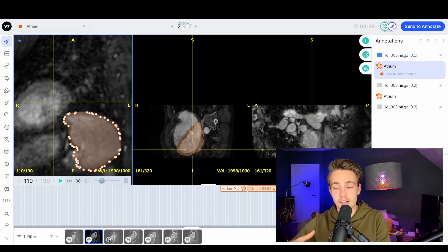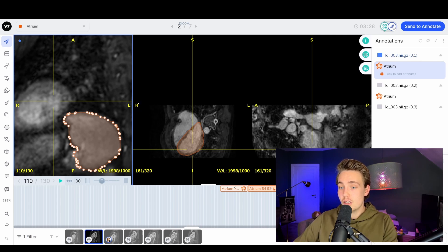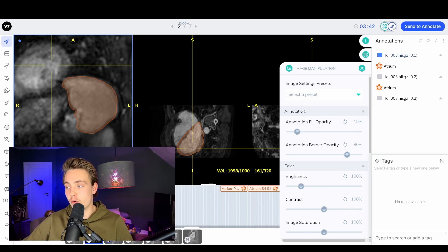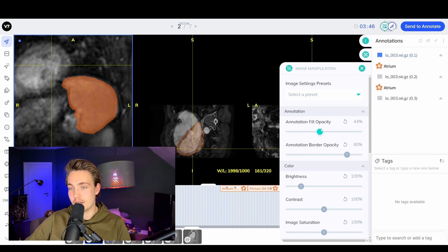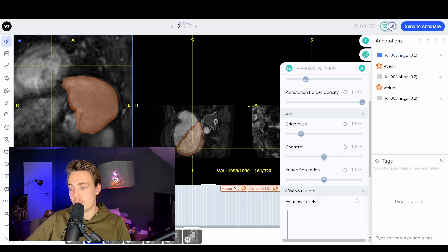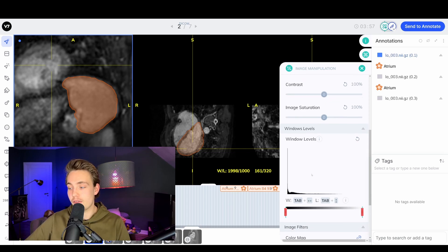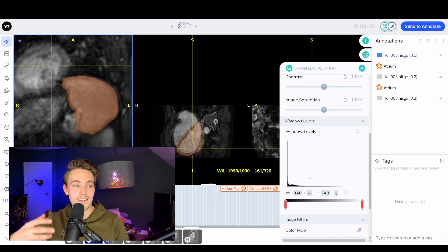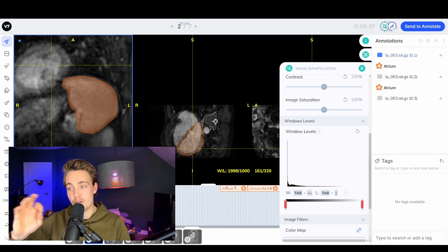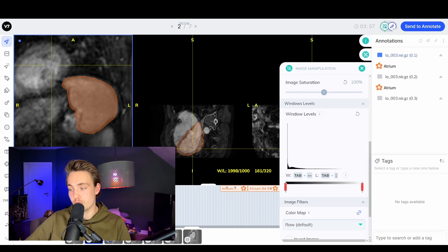We can get these different views when annotating medical images. If we go up to the top, we have some image manipulation tools. We can set presets. If we want to make annotation easier, we can adjust the annotation fill opacity - choosing the percentage of infill inside our annotation. We can also set the border thickness. One of the most significant manipulations is playing around with contrast and the histogram. We can also choose different color maps, which makes annotations easier, especially when you have a lot of different parts - here it is really hard to distinguish between different structures in these medical images.